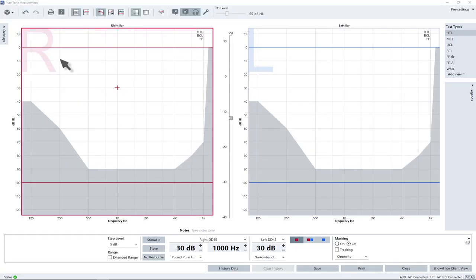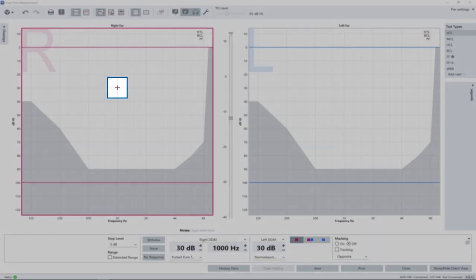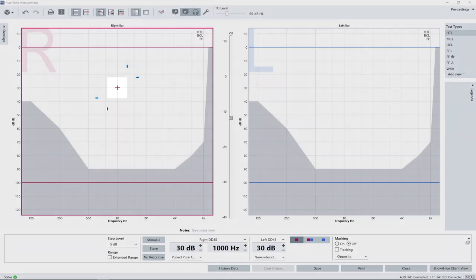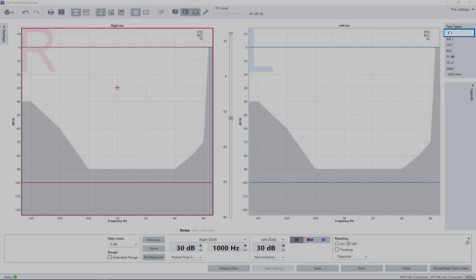The window opens with the default settings. In this example, the default point is at 30 decibel and 1000 Hz for the right ear. The curve type selected in default is the hearing threshold level measurement.